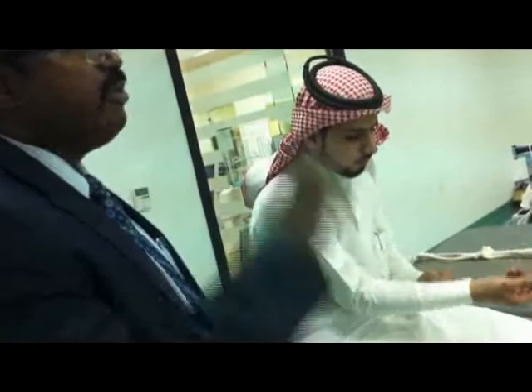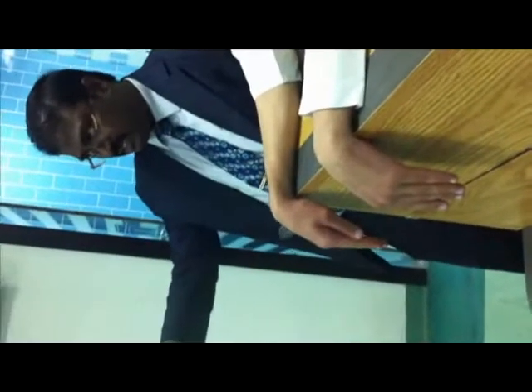Today I want everybody to divide into pairs and practice: shoulder six movements and elbow two movements. The patient can sit down and keep the hand on the table — the forearm should be supported. Therapist position beside the patient. Fulcrum for the wrist range of motion is the pisiform bone.